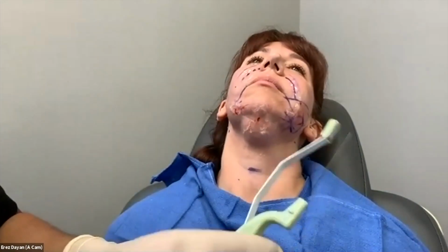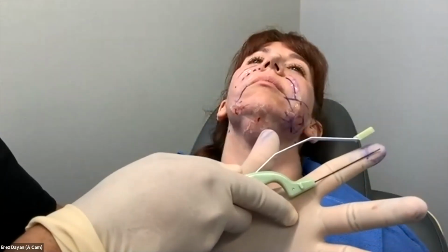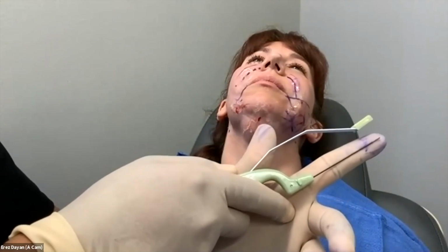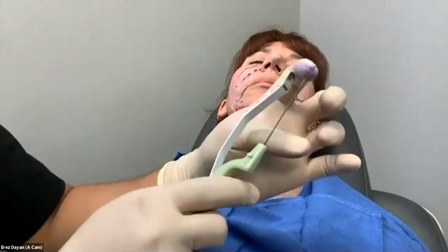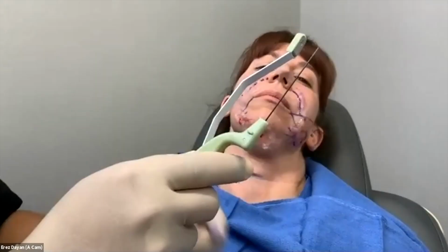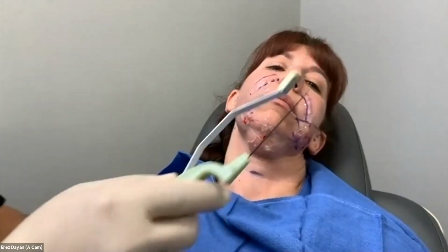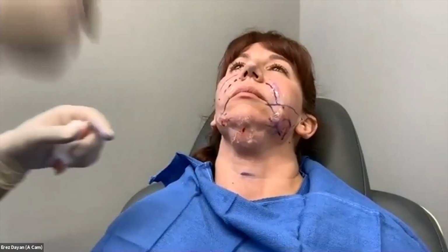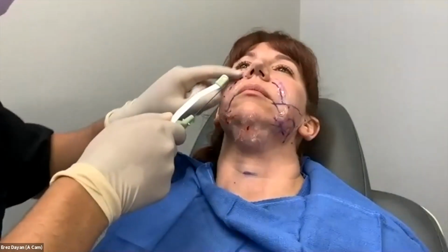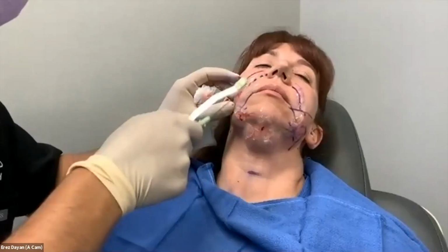So here's the Accutite. I'll just show you in relation to my finger. You don't really know what the length of my index finger is, but it's about 6 inches. This is 18 gauge. So here's where the energy is coming out of this. It's coated. It's only coming out of the tip. Everything else, the rest of the cannula, is coated. So let's start kind of top down here. So we have some gel. We have this tumesced. I already marked out the fold.